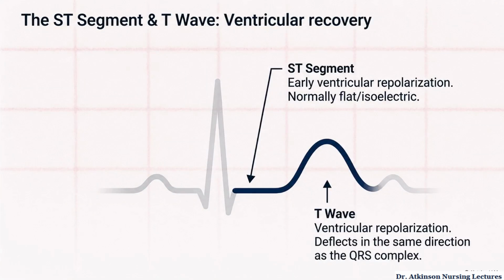The ST segment reflects early ventricular repolarization and should sit flat at baseline. The T wave that follows is full ventricular repolarization, deflecting in the same direction as the QRS complex.